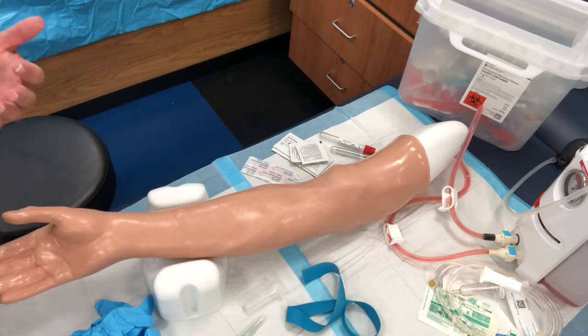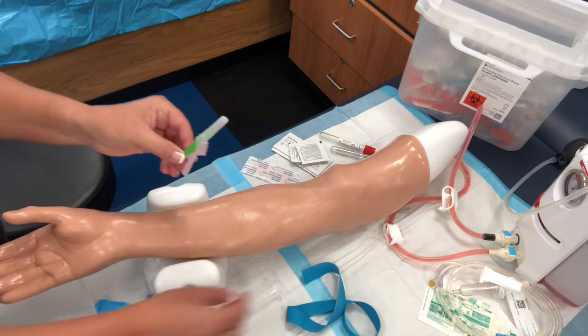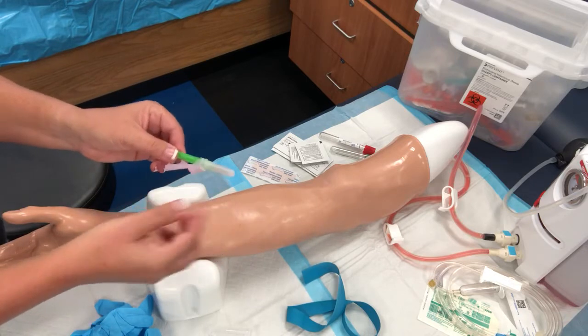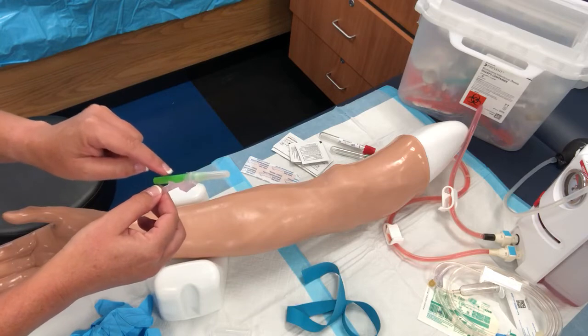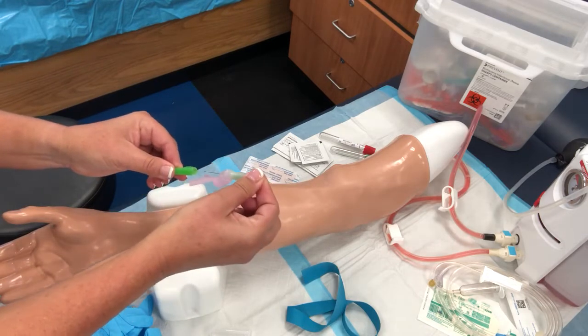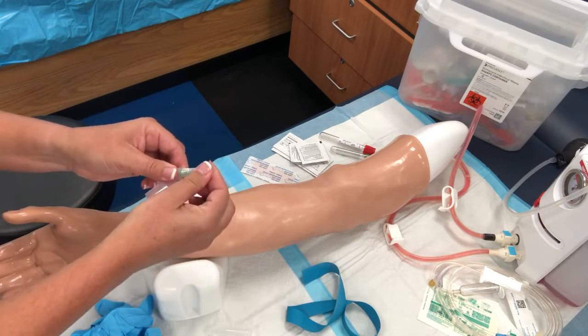Other things that you can do before you put your gloves on is you can actually assemble your needle with your adapter. So this comes with two sides. The side that has the protective device on it is always going to be essentially your needle that you're going to obtain your specimen with. The other side actually, oopsie, let's not do it that way. Obviously this one's been opened before.